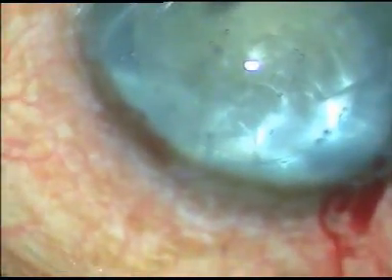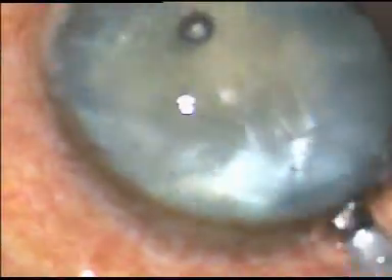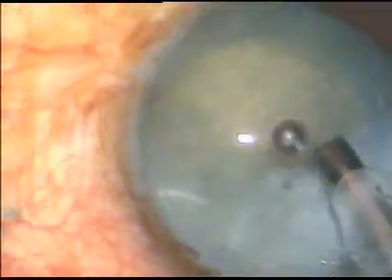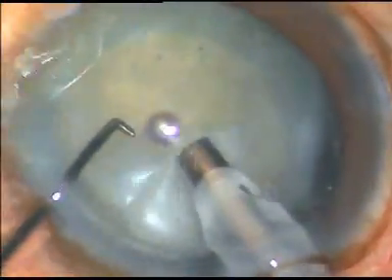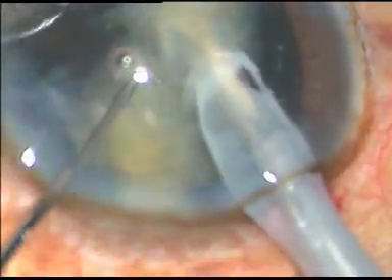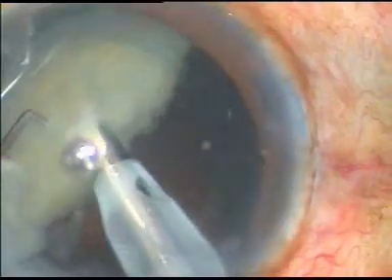The FACO handpiece is introduced. This is a soft intumescent cataract. I usually do a direct chop, but in this case, while I was going to chop it, the lens stood on its equator. So I just divided it into two halves and started engulfing it using FACO energy.